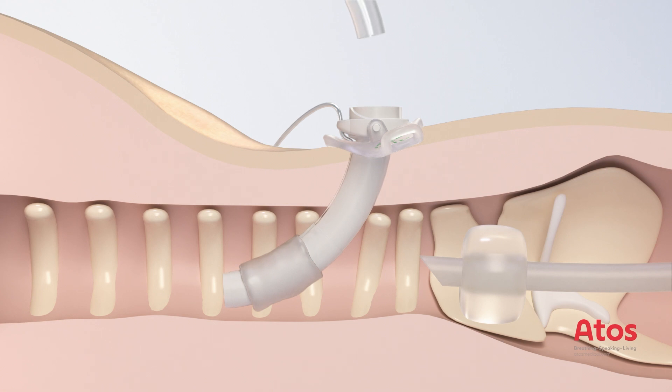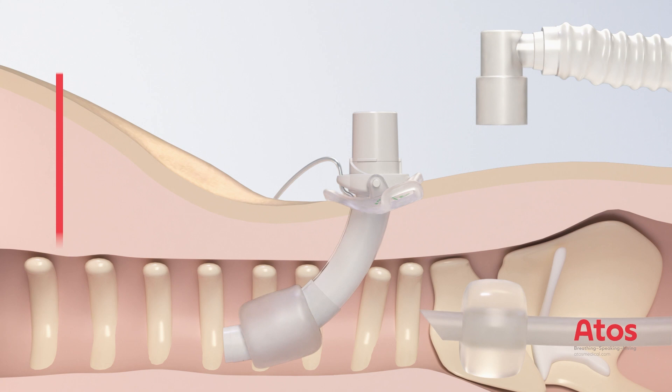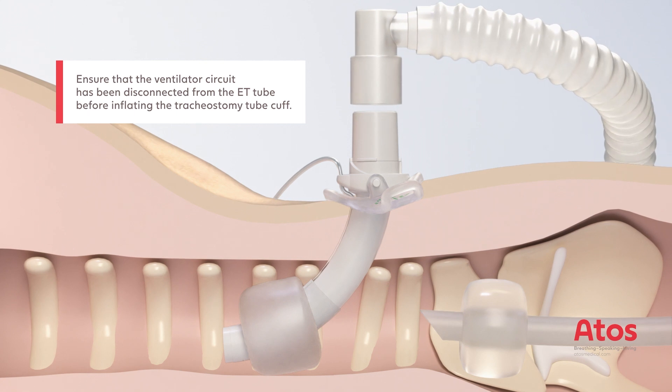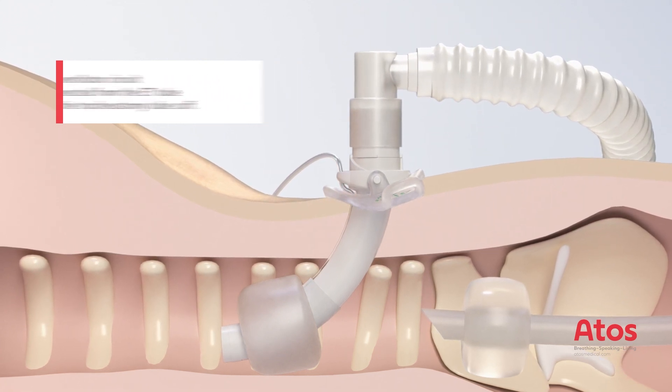Insert the non-fenestrated inner cannula and fix it in the outer cannula by turning the 15mm connector clockwise until it locks into place. Then inflate the cuff of the tracheostomy tube, disconnect the ventilation tube from the ET tube and attach it to the 15mm connector of the tracheostomy tube.